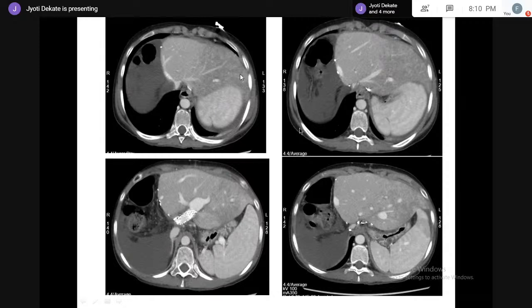This is the liver, and here we can see this part of the liver looks hyperdense, and this is the branch of the middle hepatic vein which looks okay. However, if we look at this area of the liver in comparison to this area, this looks hypodense. Again, in the other plane of the same axial sections, we can see that the left hepatic vein is tapered here because of obstruction, and that is why there is this hypodense area which marks the congested area, as we see on the biopsy in this case.